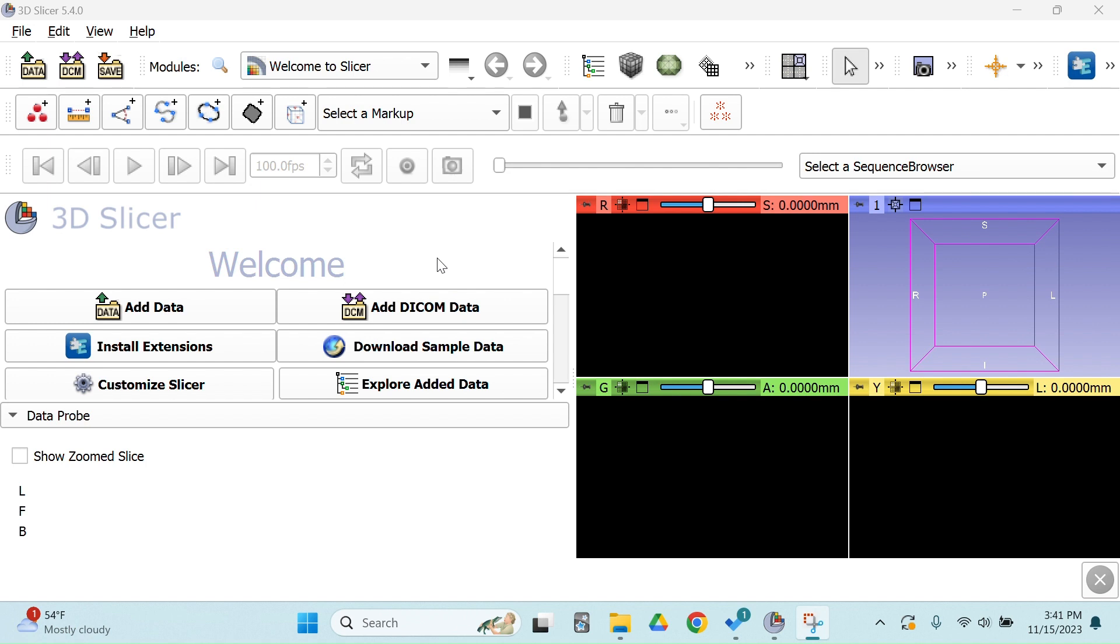Our first step is to import the DICOM file. Please make note that the DICOM file needs to be extracted. Most of them are downloaded in zip format because they're so large, and it needs to be on a local drive, so you cannot edit a file that's on the cloud or in Google Drive.